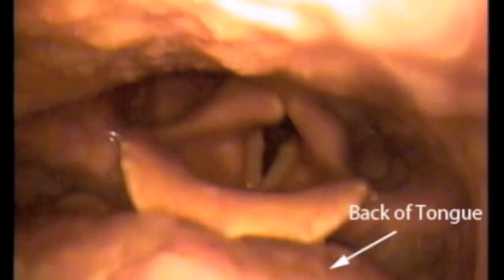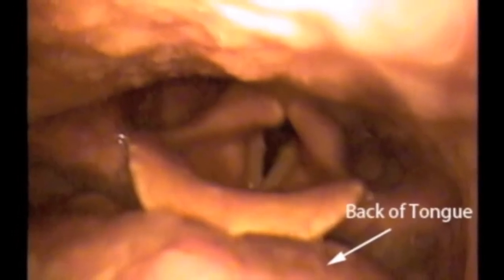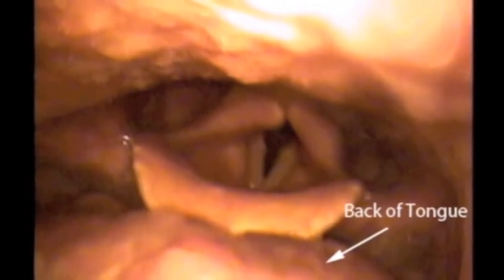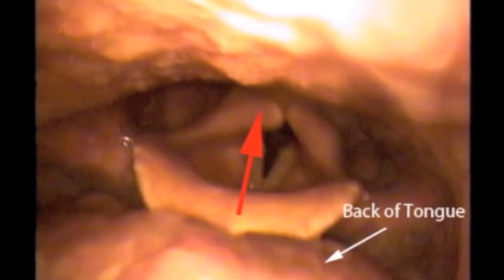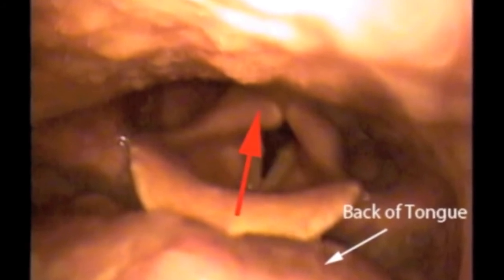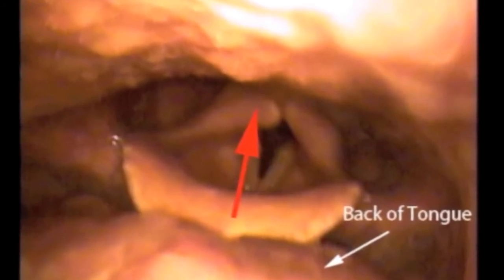Here is what it looks like from the inside. Watch how the tongue falls into the airway resulting in a partial obstruction. When the tongue falls in the direction of the red arrow, the narrowing results in mucosal vibration resulting in a snore.